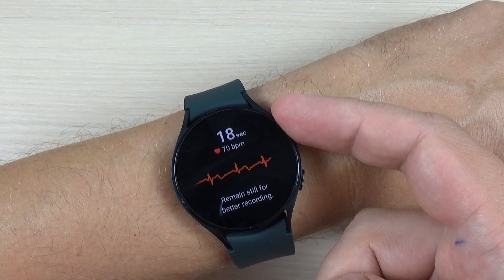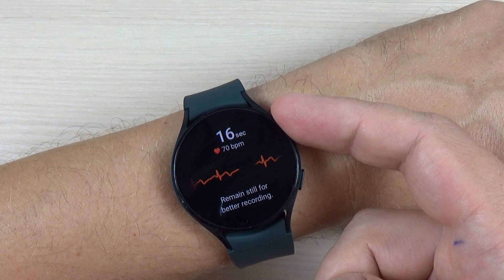Hi guys, in this tutorial I will show you how to measure ECG on your watch, so let's do it.